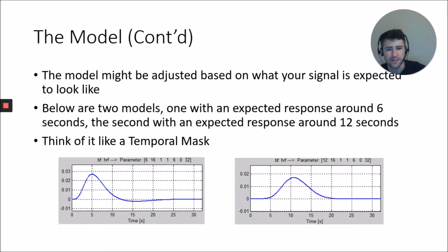So the standard is over here on the left. You'll see it has a peak value of around 6 seconds. It drops back down and overshoots the baseline to about 15 seconds, and it flatlines after that.